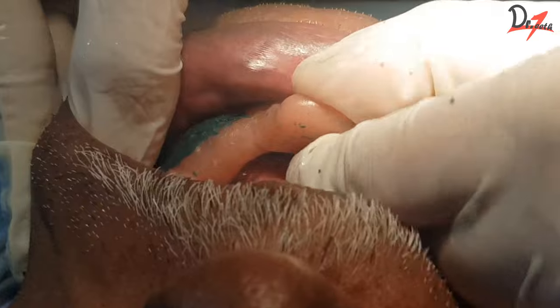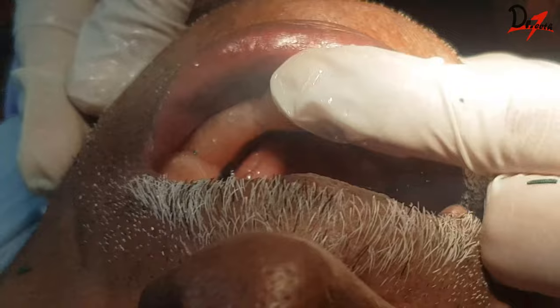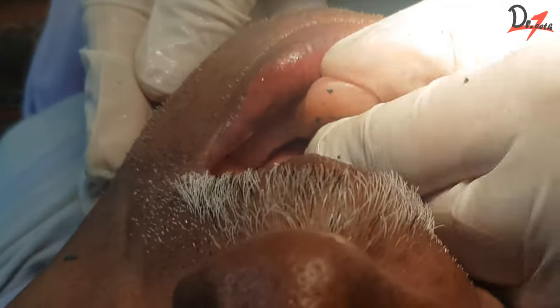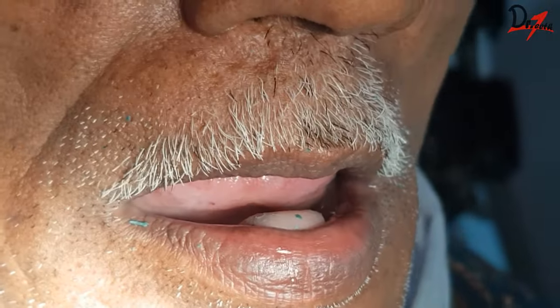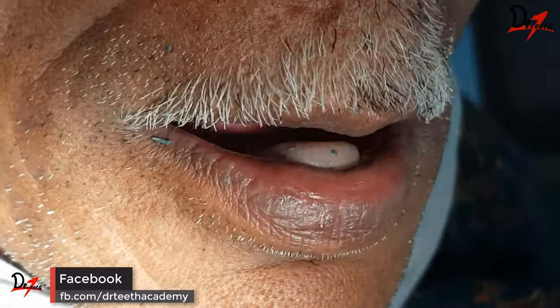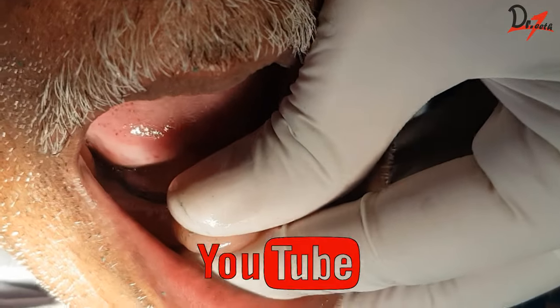Let us check the retention — this is the anterior retention and this is the posterior retention. As you can see, it is very difficult to take it out. Then have some talk with the patient and see if there is any displacement of the tray; if there is, you have to adjust it. After we have verified everything, we'll remove the wax spacer and make holes in the tray to take the wash impression.